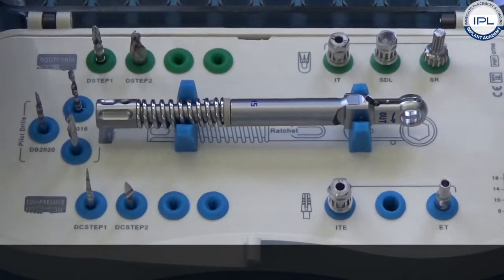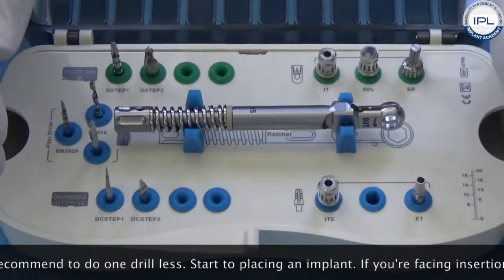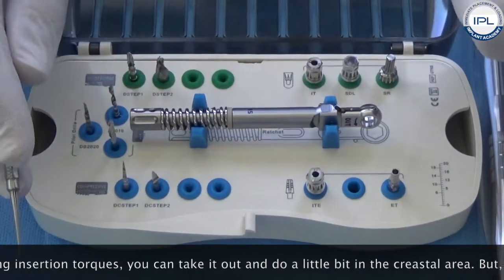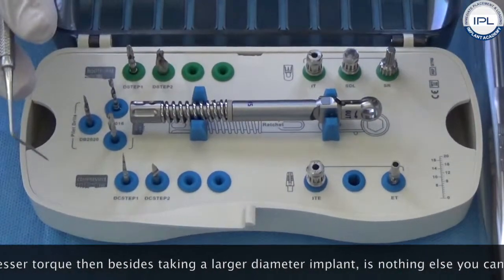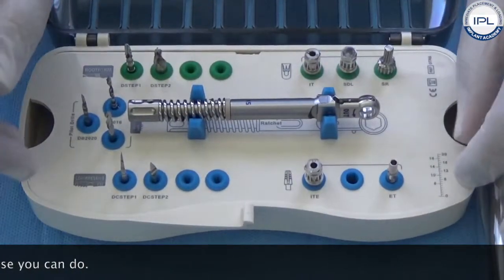My recommendation is always to do one drill diameter less, then start to insert the implant. If you face very high insertion torques you can always take it out and drill a little bit in the crestal area. But if you over-drill and get lesser torque, then besides taking a larger diameter implant there is nothing else you can do.